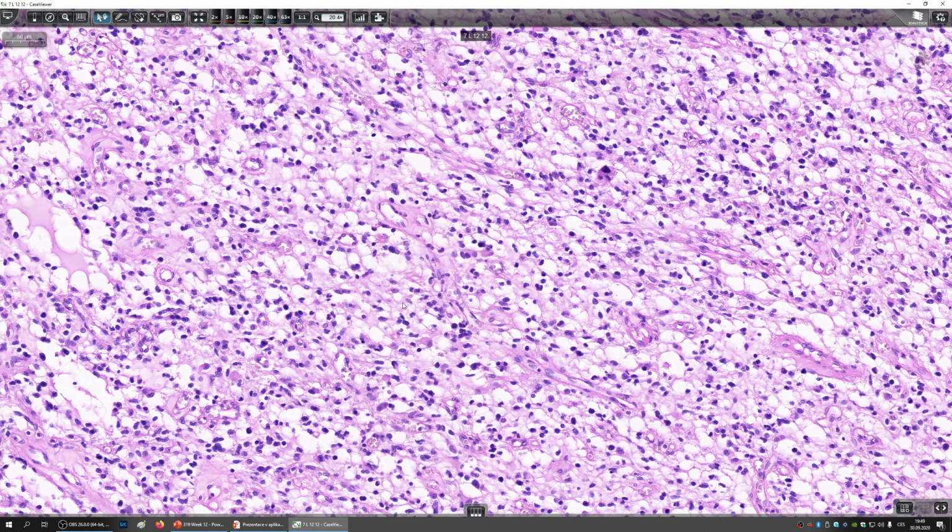So in general, tumors with grade 2 astrocytoma or diffuse astrocytoma, they survive for a long time, but the problem is that this tumor is diffuse, that's what it's called, and it grows diffusely with very poorly circumscribed borders. So it's quite difficult to remove.